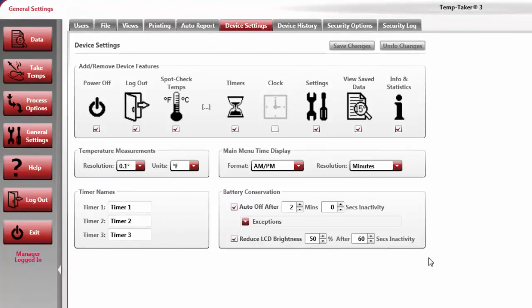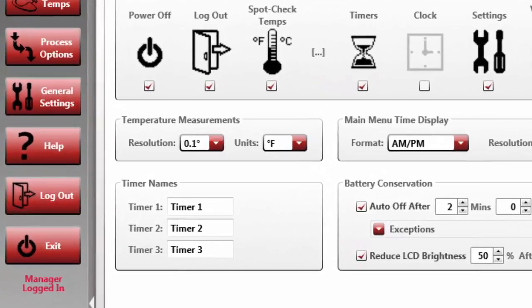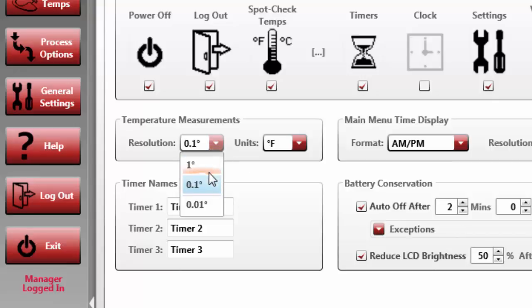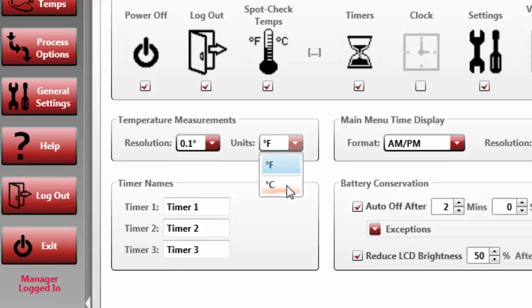Immediately under the Device icons are toggles for both temperature measurement and time and date displays on the handheld unit. The Temperature Measurement section provides two toggles that control the degree resolution and units of measure for how the hardware will display temperature on the handheld's LCD display. Resolution can be set at whole numbers, tenths of a degree, or at hundredths of a degree. The units of measure can also be adjusted to read as either Fahrenheit or Celsius.